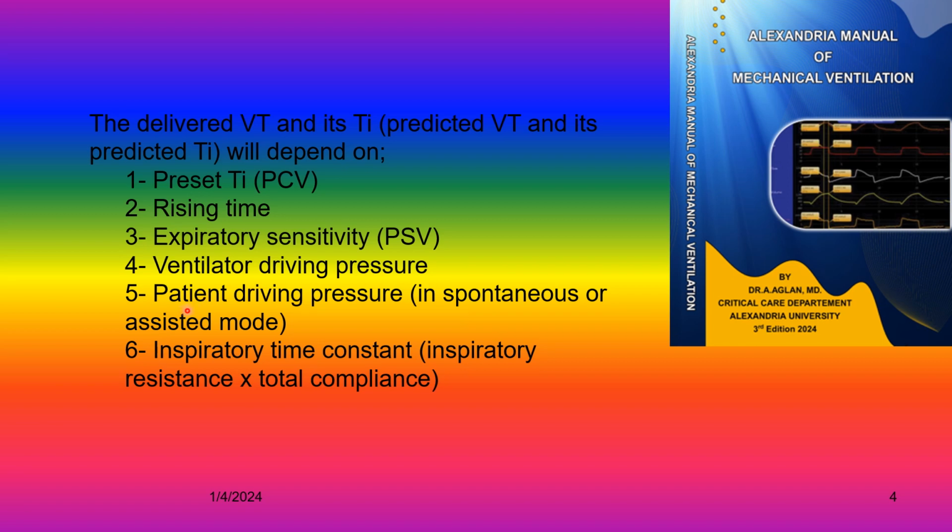In addition to these, the patient driving pressure and the inspiratory time constant, inspiratory resistance, and total compliance. All of these determine the predicted tidal volume and its predicted inspiratory time.